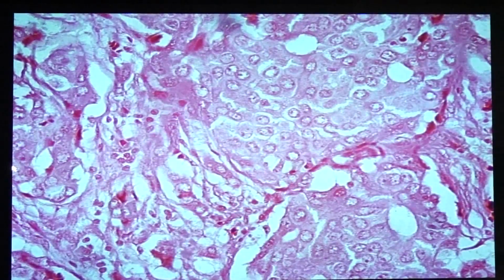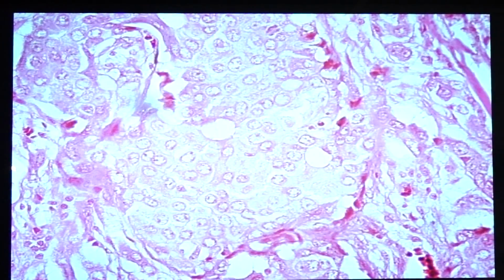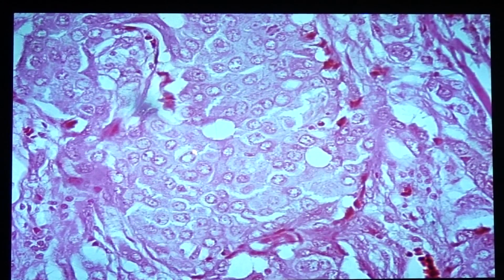mitosis. So if the cells happen to have mild nuclear pleomorphism, it should mean that they are fairly uniform, absence of mitosis, presence of tubule formation, it would be grade 1. Okay? If we do not have mitosis but have marked pleomorphism, no tubular formation, that would be grade 2. And if you already have all of those three criteria present, then it would be grade 3.